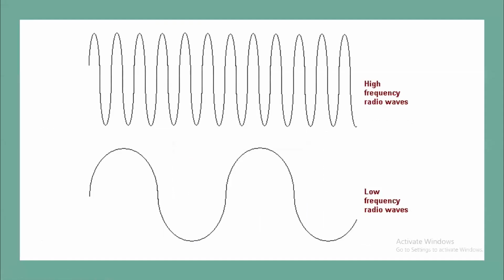Of course, the physics is a very, very complex issue. As I said before, we'll try to make it very simple for us. One thing we must know about point of care ultrasound is the frequency. Frequency is how much something happens in a period of time. So the wave frequency is the number of waves that happen during a second.